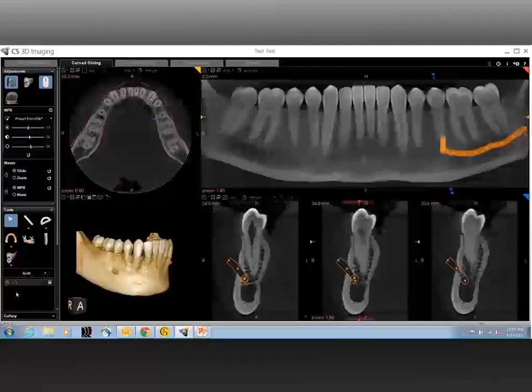So from what I'm getting, the clinician should note not just the pathological findings. They need to input these into a chart to record that the scan was actually evaluated. And if they're finding something in the scan that they're not confident of a diagnosis, they should look to an expert for those.